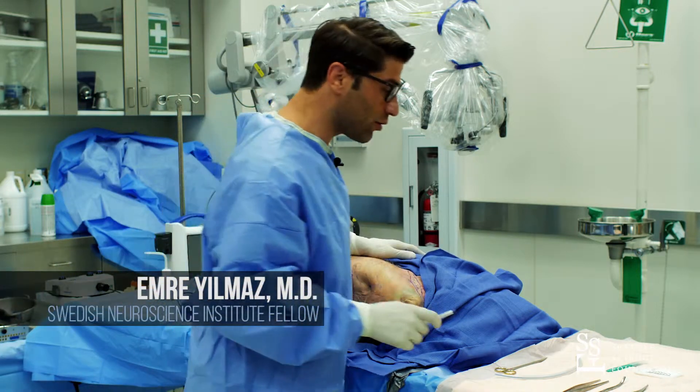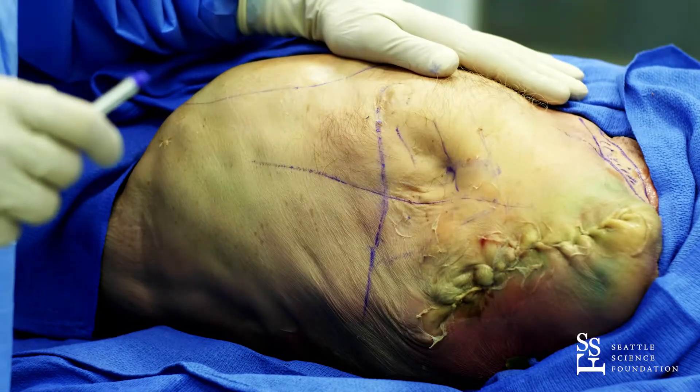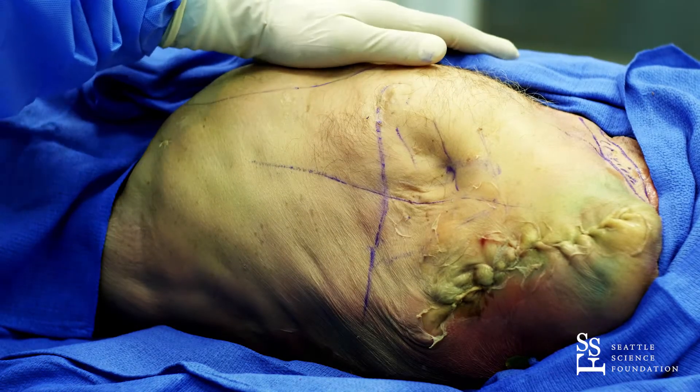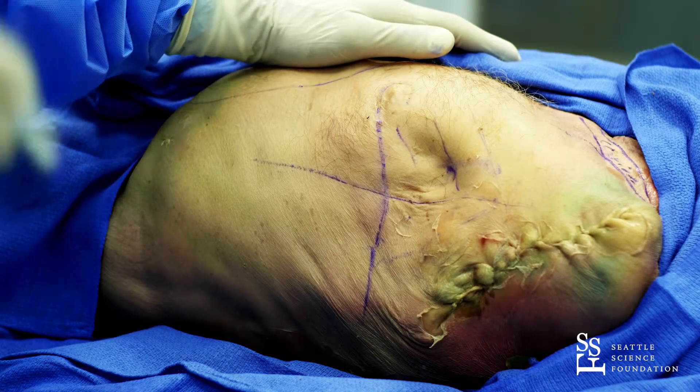I'm going to show you how to do a chest tube. Before we start, we position the patient on the back. The device that we need to connect the chest tube after placement should be ready and prepared.